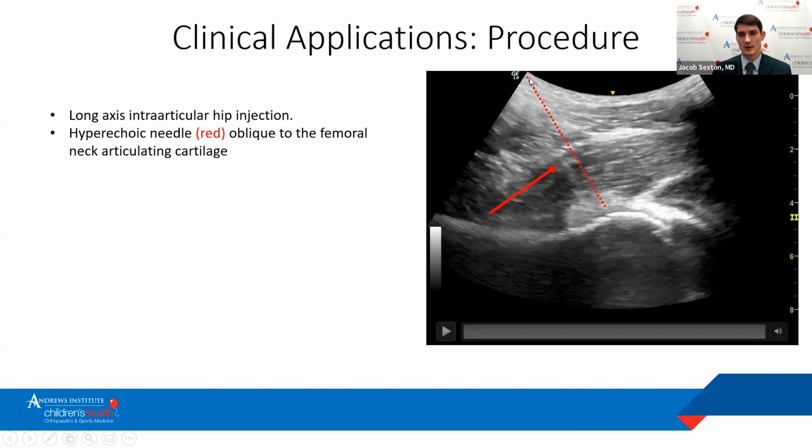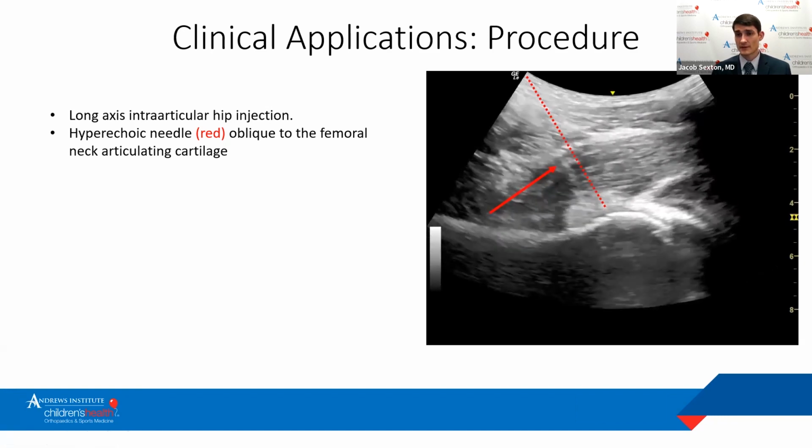So when I'm doing this image, I'm kind of focusing down and want to make sure I hit that bony structure into the hip capsule. And so on this image, you can see very subtly, but you'll see the needle right there wiggling. And once I do that, I know I'm in the appropriate position. I can deposit whatever medication I'm using at that time. And once I see it go directly into the capsule joint, I know that if the underlying procedure works, it's both diagnostic and therapeutic. And then I know if the procedure doesn't work at that time with this accuracy, then I know we need to be looking at some other tissue structure.